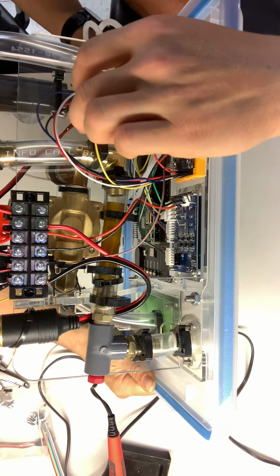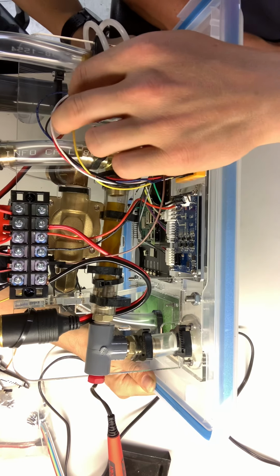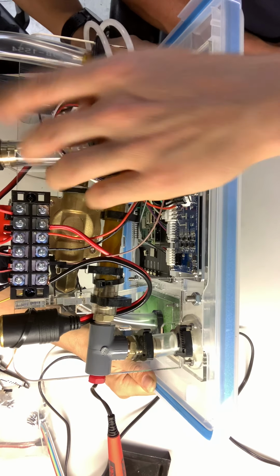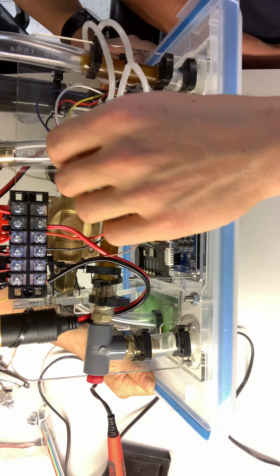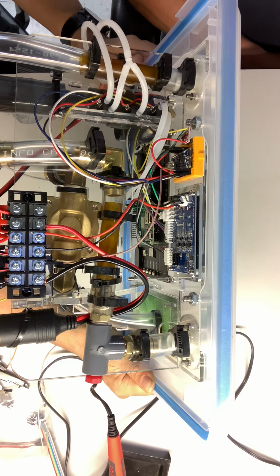Which is patient inhale. Yeah, it's not pin 6, it's just the 6th one up from the bottom there. Got it. Because they're not labeled here. But that's the inhale differential signal. And then the patient pressure is on the 7th pin, and that's the white here. Yep. This is the middle one. Cool.